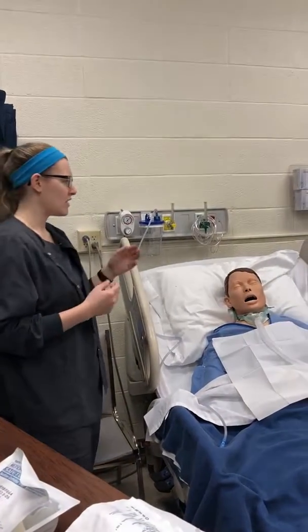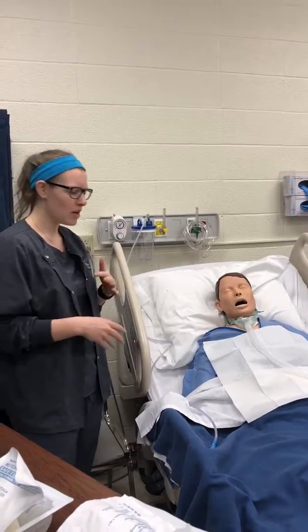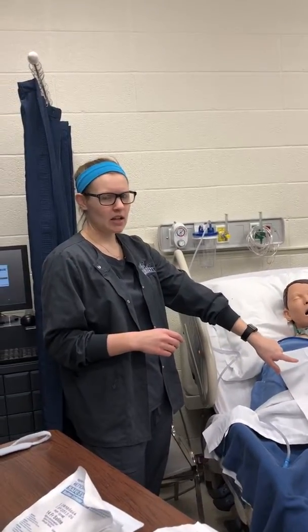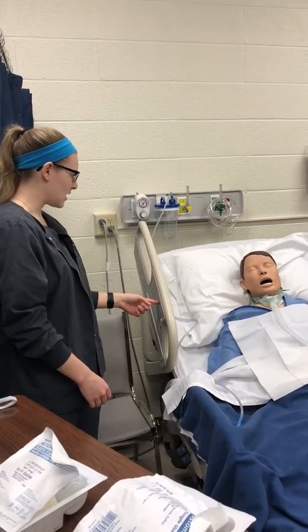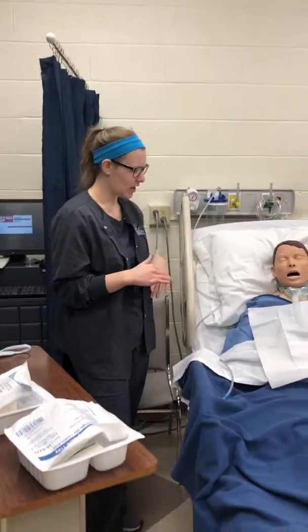My patient and I have established a way for her to be able to give me a thumbs up if I need to stop or anything like that. I've also got this pad on the patient's chest to make sure that we don't get stuff everywhere, and I'm going to set them up into a high Fowler's position just to help with the suctioning and how they're breathing.